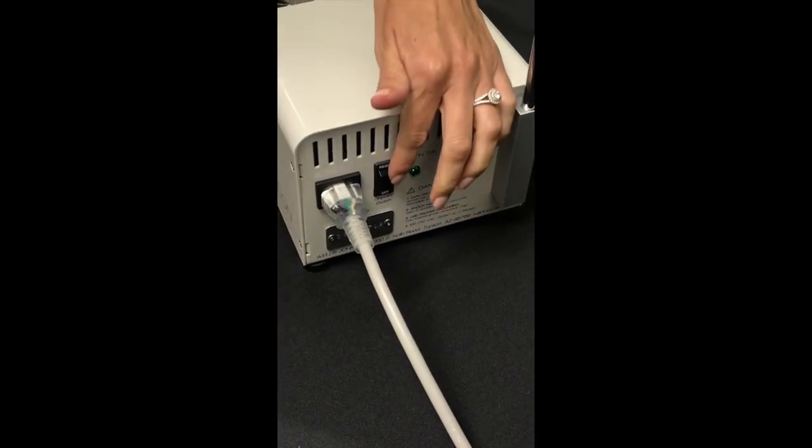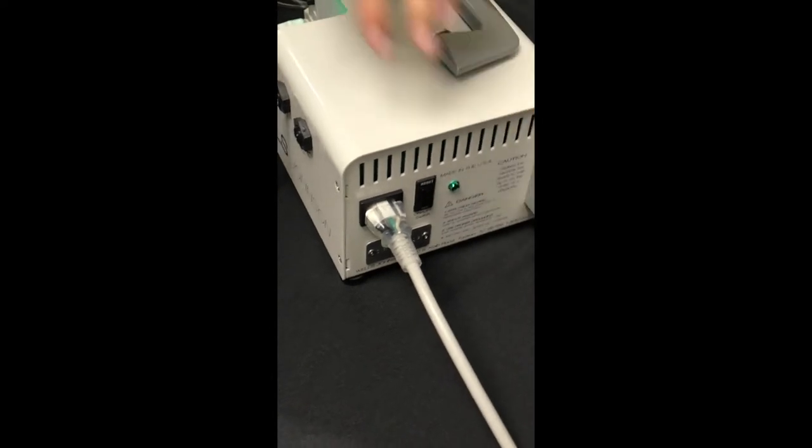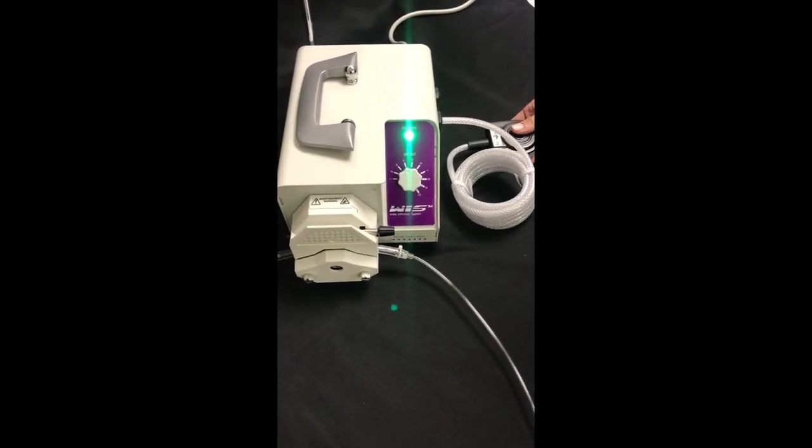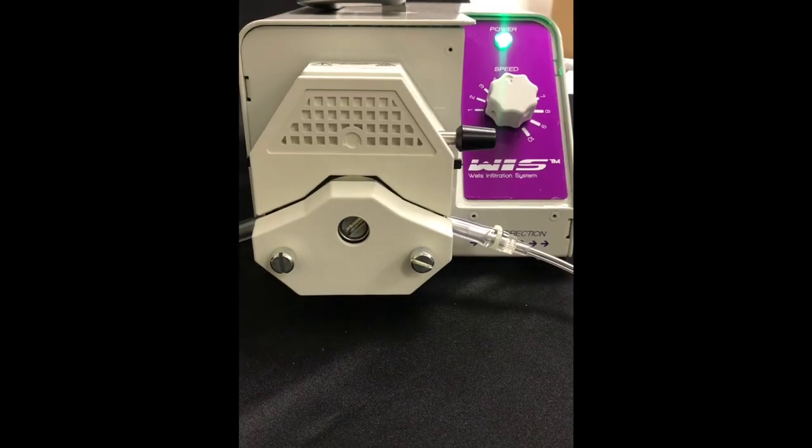Located on the back of the infusion pump, you will find the power on button. Using the pneumatic foot switch, you are now ready to infiltrate using your Wells Johnson infusion pump.